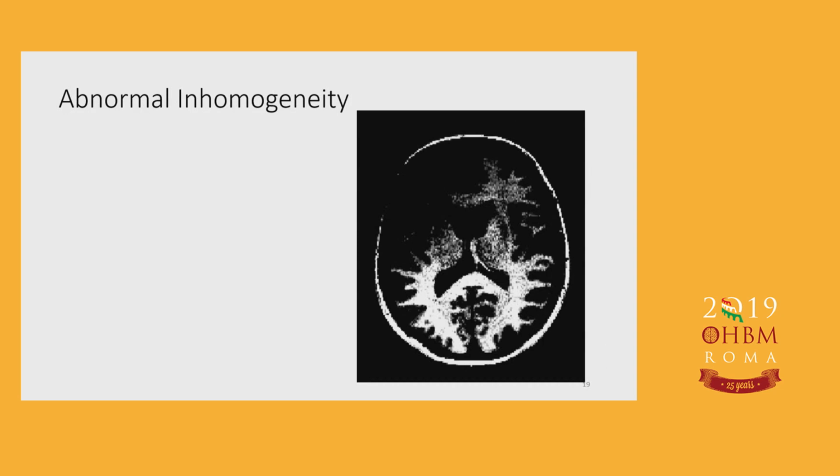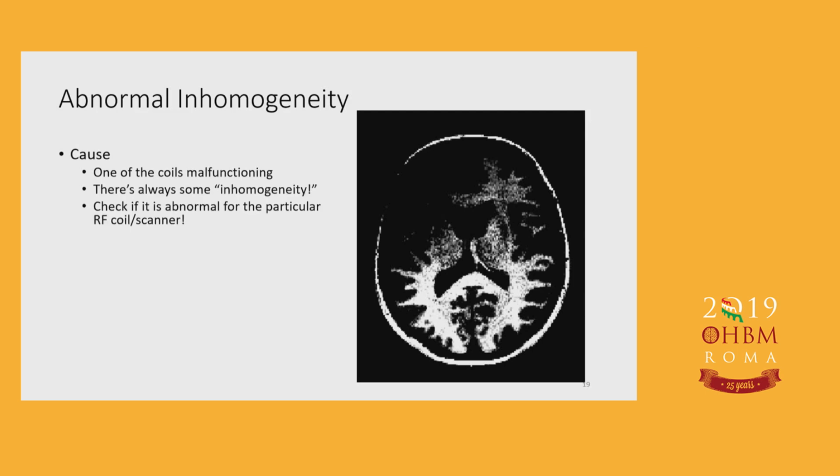The next artifact is called abnormal inhomogeneity. A common cause is one of the coils malfunctioning in the setup. It's important to note that most systems, most multi-channel RF coils, do have some inhomogeneity in them. Sometimes they're designed for it, but what we're looking for is something that's abnormal for that particular coil, right?